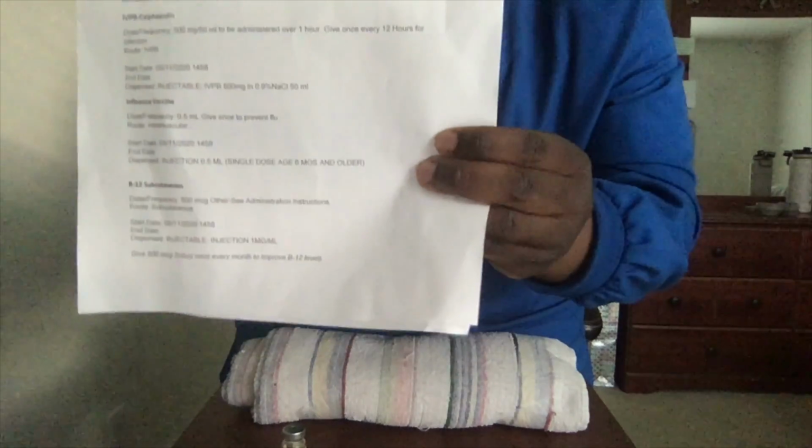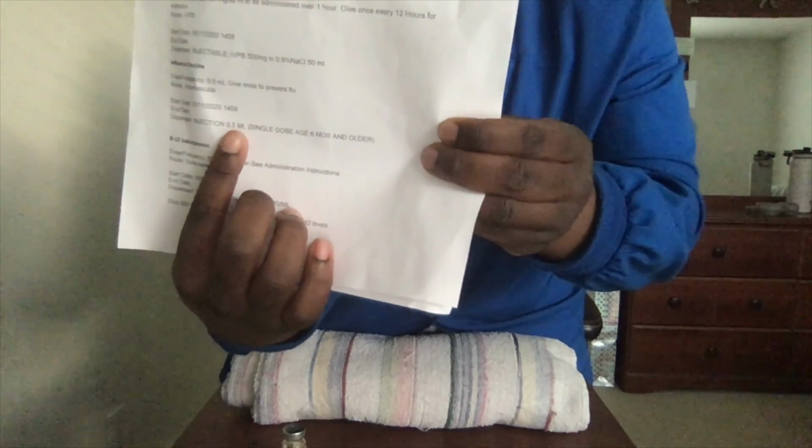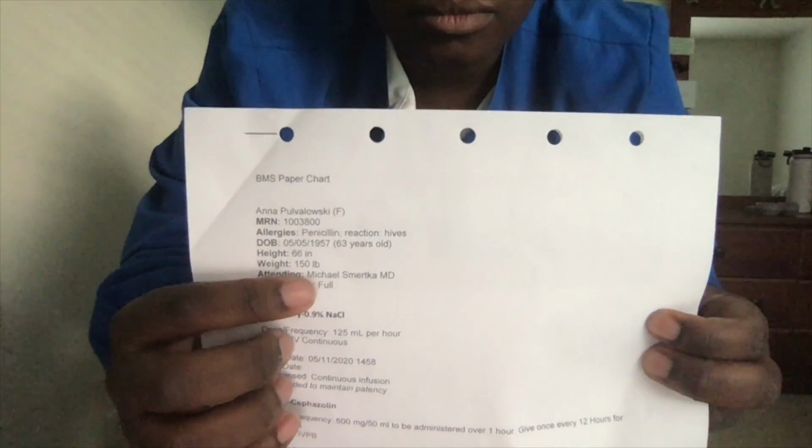1/2 milliliter of fluid is needed, and 1/2 milliliter of fluid is what's going to be given because there's only 1/2 milliliter of fluid inside of the vial, so no calculation necessary. Lastly, it needs to be given once to prevent the flu, and this is flu season. Additionally, the documentation is correct because it has been signed off by the doctor, as stated here. Now I've completed my first set of 6 rights. I'm going to inspect the vial to make sure it hasn't been tampered with, nor is it expired. It wasn't, and it isn't.